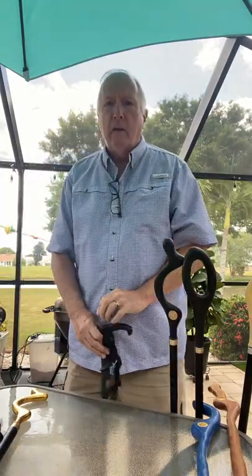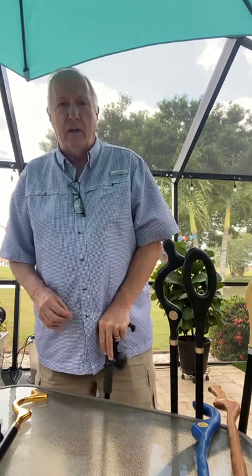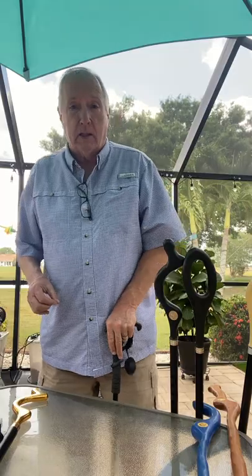When someone has a regular cane, usually they give them the cane for one main purpose: to take pressure off a joint. You got an injury like I did years ago when I tore my quad off. I had to be on crutches for a little while and a cane because I felt a little bit unstable.